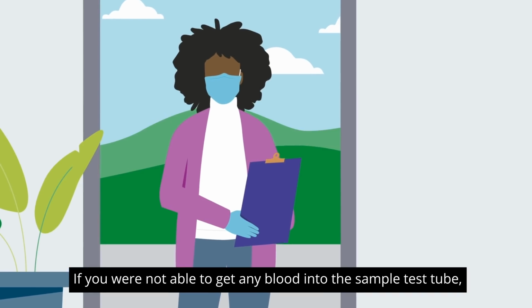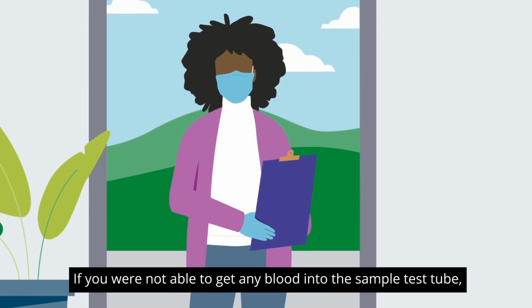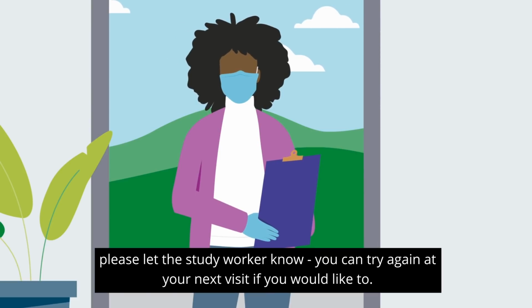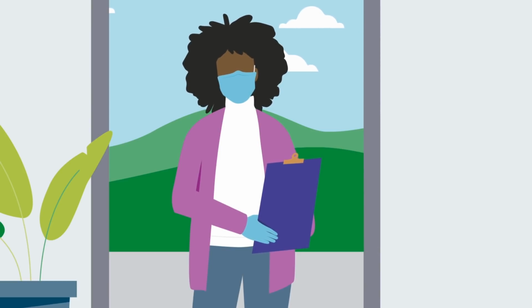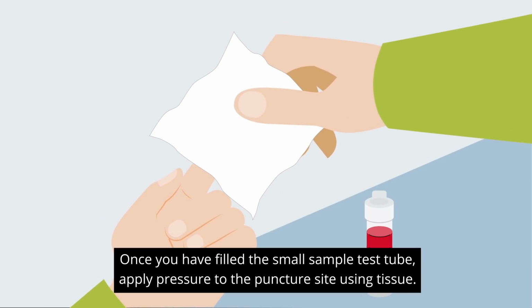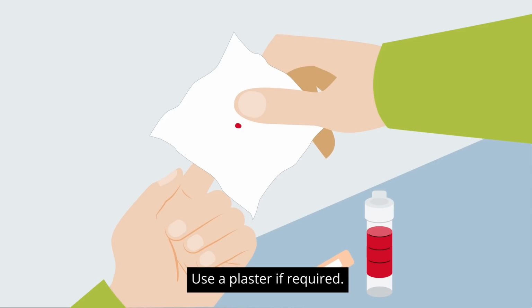If you were not able to get any blood into the sample test tube, please let the study worker know. You can try again at your next visit if you would like to. Once you have filled the small sample test tube, apply pressure to the puncture site using tissue. Use a plaster if required.